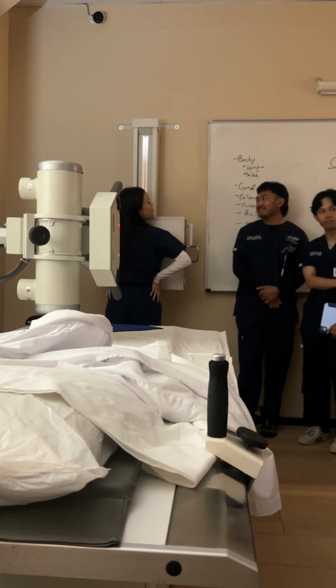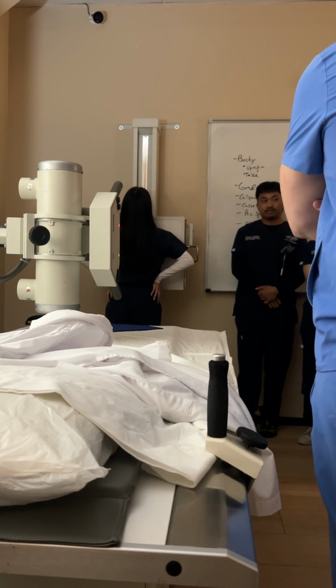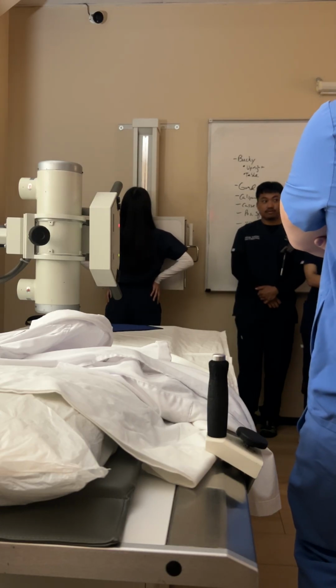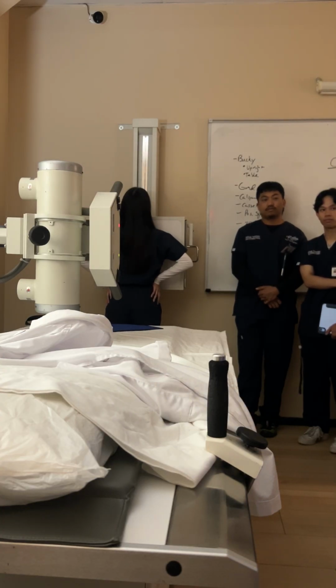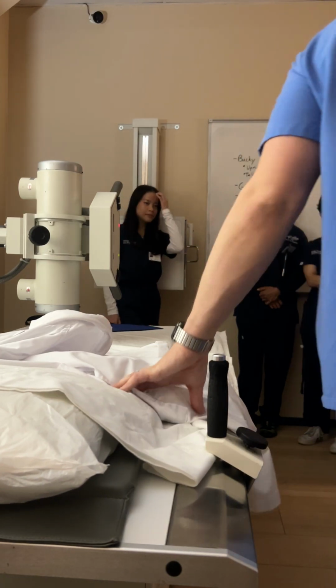This is what we're here for, right? Okay. Go ahead and take a deep breath in and blow it out, and then you're gonna take another one for me, and before you blow out, please hold. Right. Yeah, good. So simplify it even further, okay? Because, and I'm telling you this because people, when they're in this moment, they go to a different plane of existence. They're like freaking out, right?